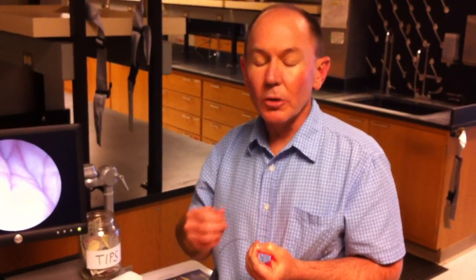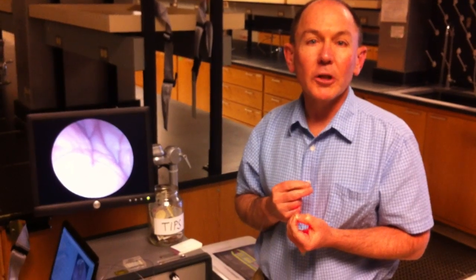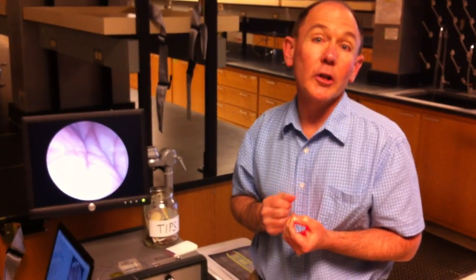And you said in the liver primarily, so why is that an area that you need to get this sort of level of detail? Well, one of the areas we're going into, and there's many areas we will, but the bile duct, into the bile duct, which goes up into the liver, is one of the areas we're looking at. Because there are no high-resolution scopes that can go up there and image in that area currently.